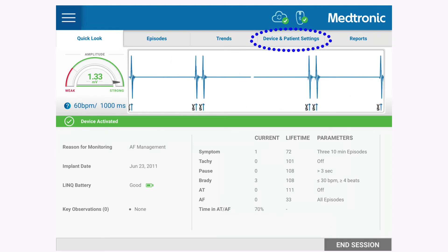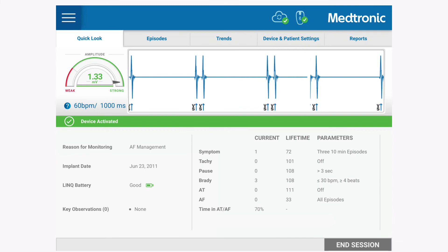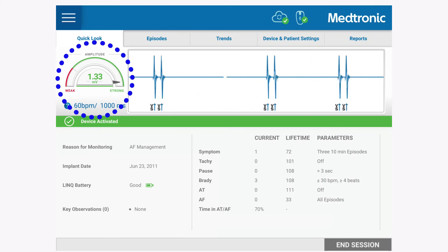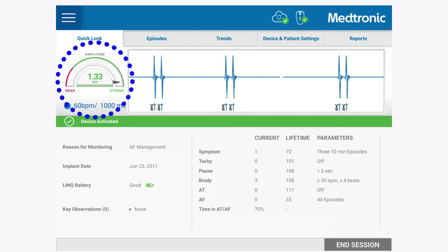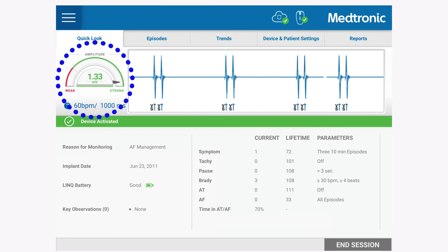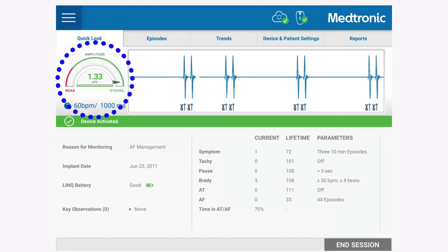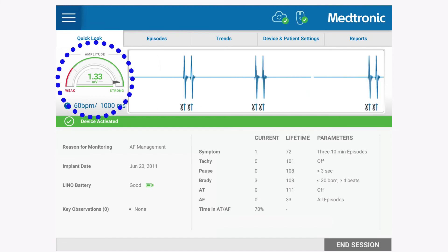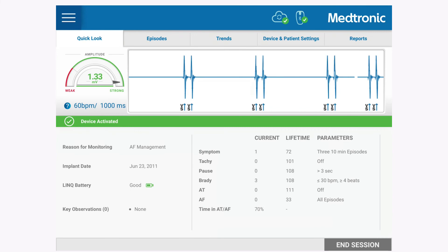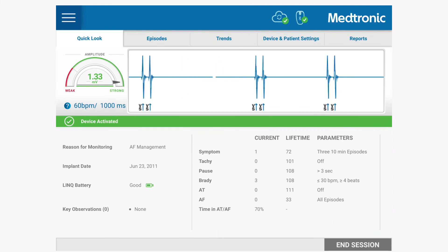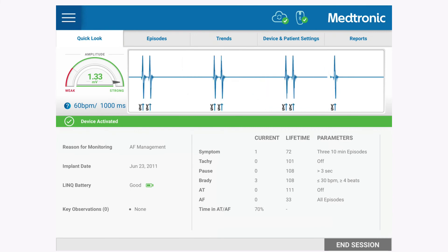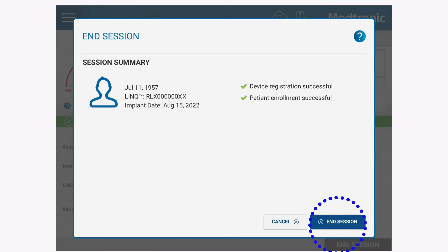To ensure desired device sensing, the R-Waves should ideally be 0.2 millivolts or above. This can be seen and confirmed on the Medtronic RevealLink Mobile Manager. After ensuring the Medtronic RevealLink is programmed appropriately for the patient and the R-Waves are satisfactory, clicking End Session will complete the workflow.